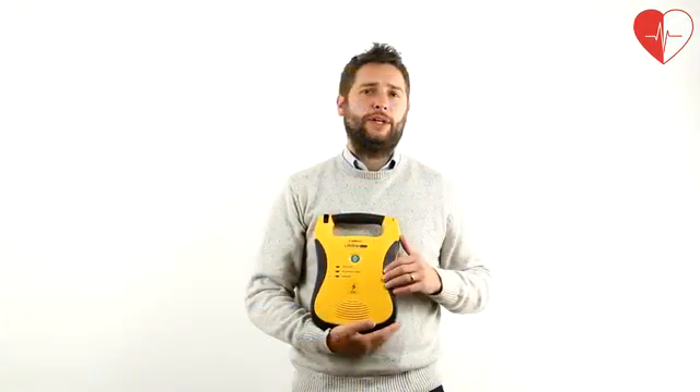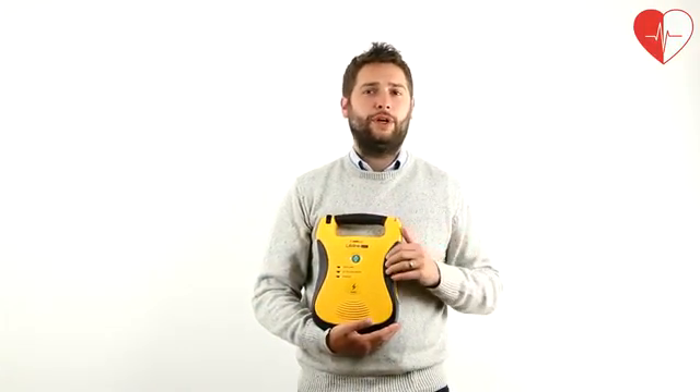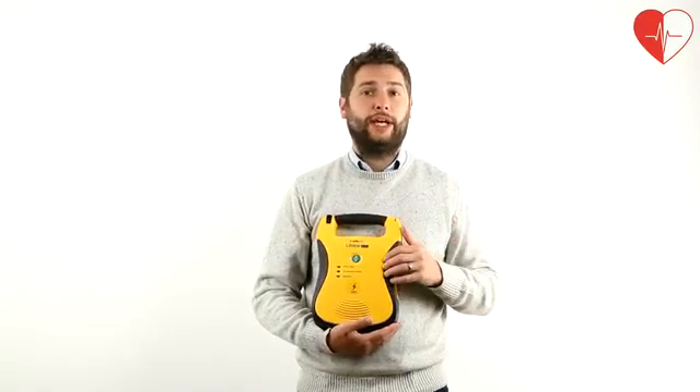As with all fully automatic defibs, the patient's vital stats will be analyzed and the unit will report whether it will deliver a therapeutic shock automatically, following a warning to the responder.